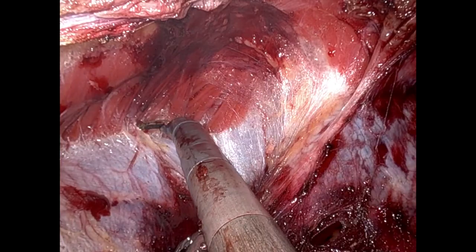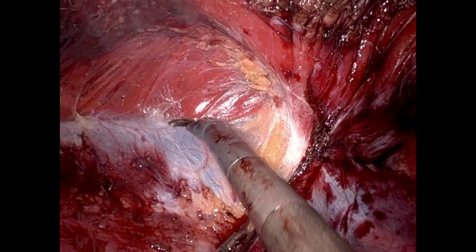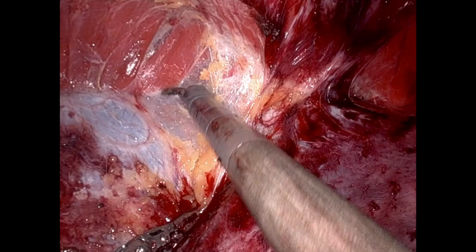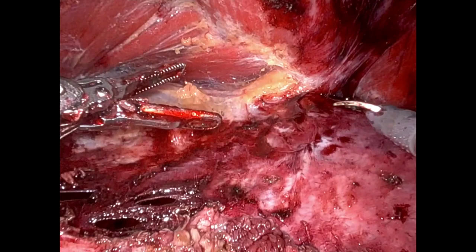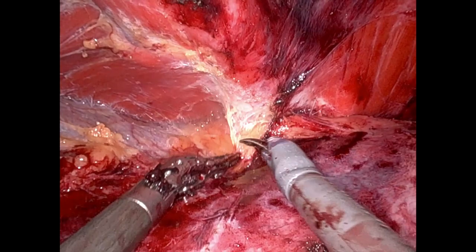Here we're in the upper abdomen on the patient's left side, performing a subdiaphragmatic dissection. We knew we would need to do this, as the patient's hernia extended all the way to the xiphoid process. This is a classic, very reproducible area of the abdominal wall. You'll often find a fat pad that sits between the diaphragm and the transversus abdominis muscle around the 11th and 12th ribs.